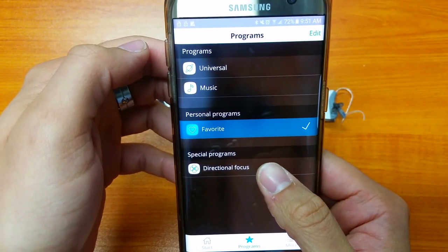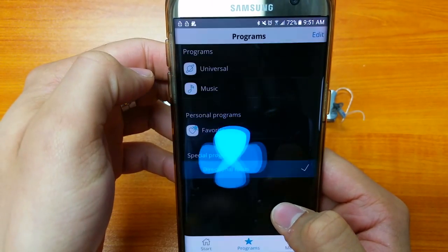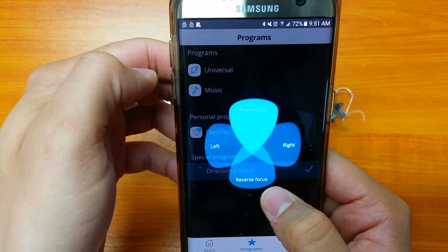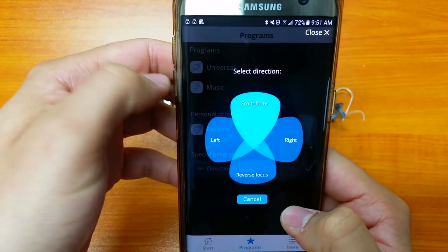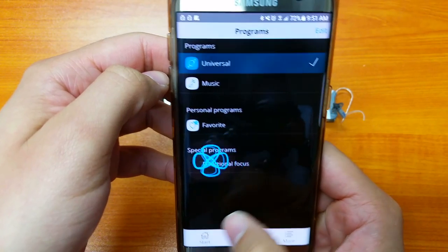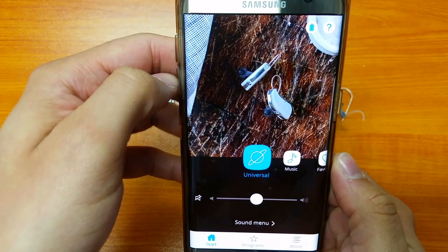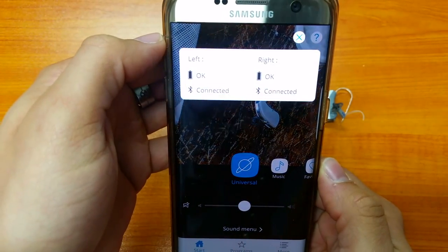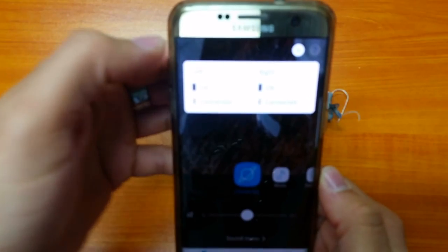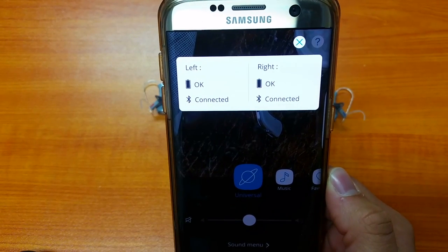Another feature we like is the Directional Focus. You can choose to focus the hearing aids to the front, back, left, or right, giving you more control. At the top you can also check battery status — it tells you the batteries are looking okay and that the device is connected via Bluetooth.